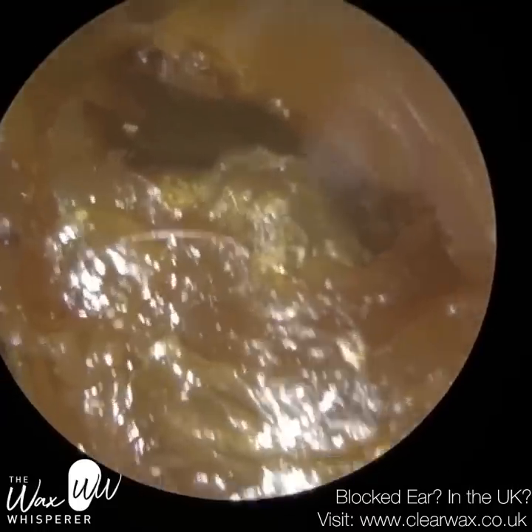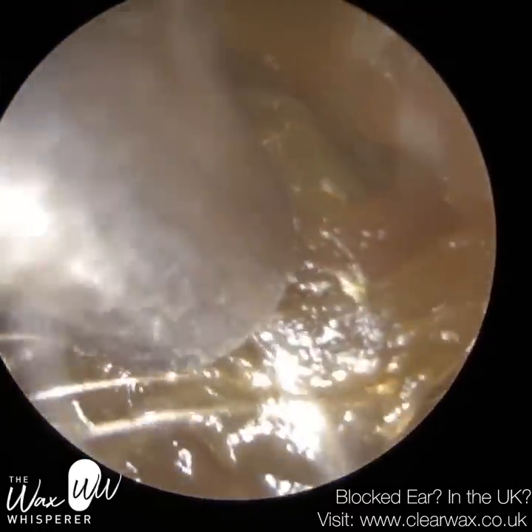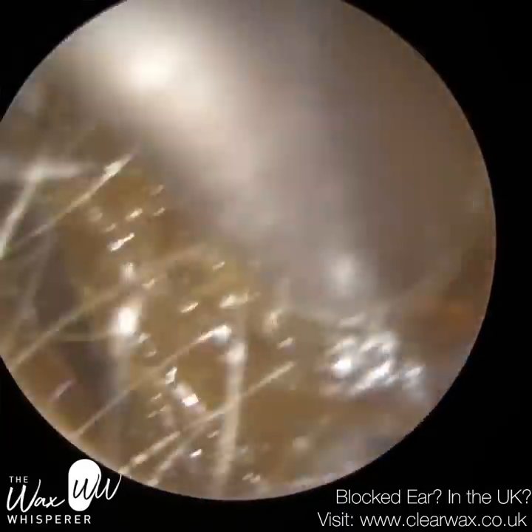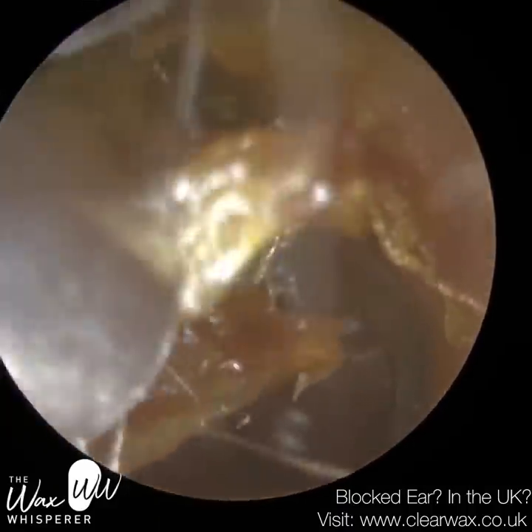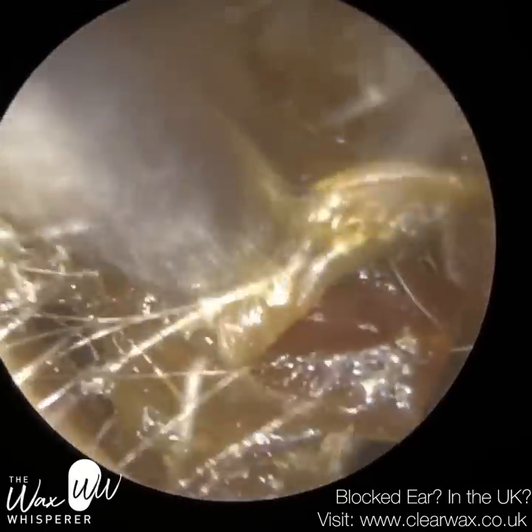I'll give you some background on this particular patient. They've had multiple ear surgeries in both ears, including the removal of a cholesteatoma in the right ear previously. And if you watch till the end of the video, you can see what their operated ear looks like.